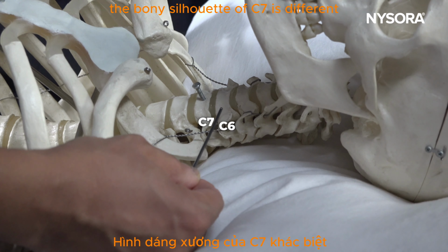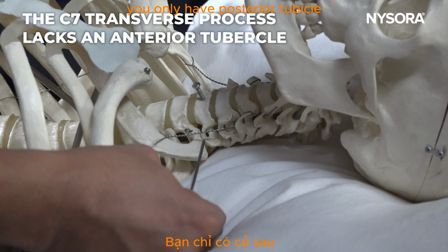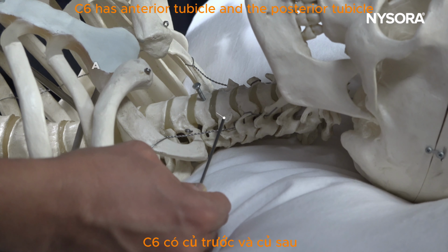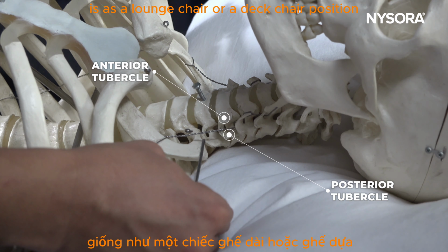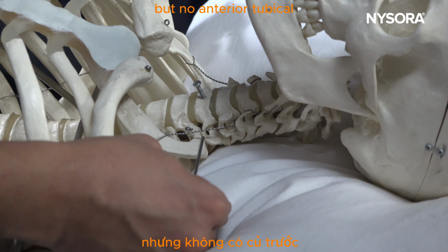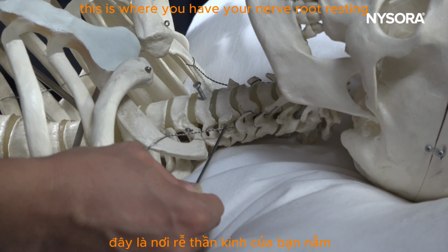Now, the bony silhouette of C7 is different because C7 lacks an anterior tubercle. There is no anterior tubercle. You only have a posterior tubercle. On the contrary, C6 has an anterior tubercle and a posterior tubercle. So the bony silhouette you get with C7 is what I call a lounge chair or a deck chair position, where you only have a posterior tubercle but no anterior tubercle. But when you look at the C6 or C5 or C4 level, where you have an anterior tubercle and posterior tubercle, this is where you have your nerve root resting.